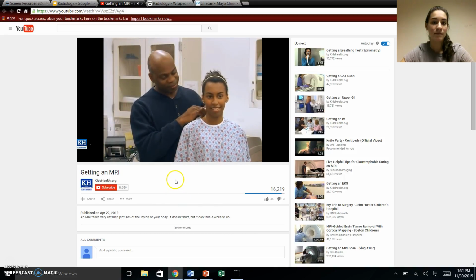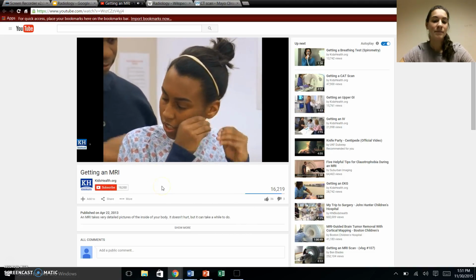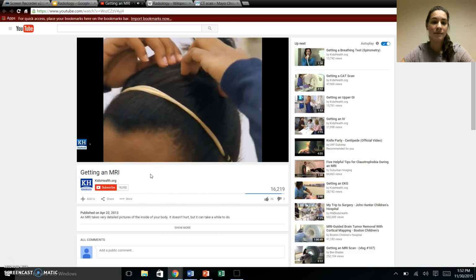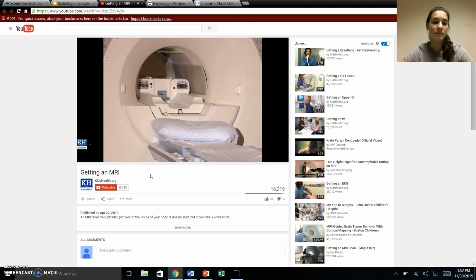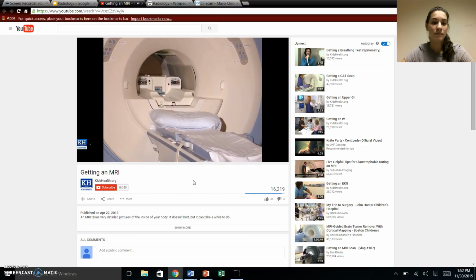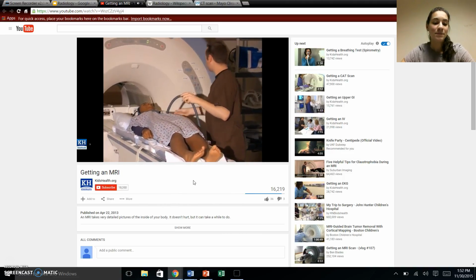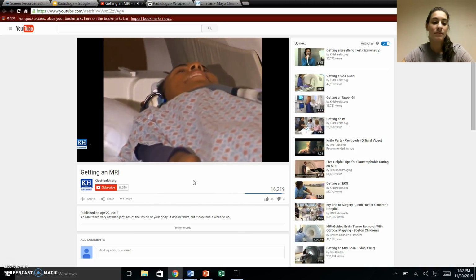First, you change into a hospital gown. You'll have to take off anything metal like jewelry, watches, and glasses. The MRI machine won't work right if you're wearing metal. The MRI machine looks like a giant donut with a table or narrow bed that slides into the donut hole. The donut is actually a scanner. You may be given headphones. They'll help you talk with the technician, tech for short, and you can use them to listen to music.